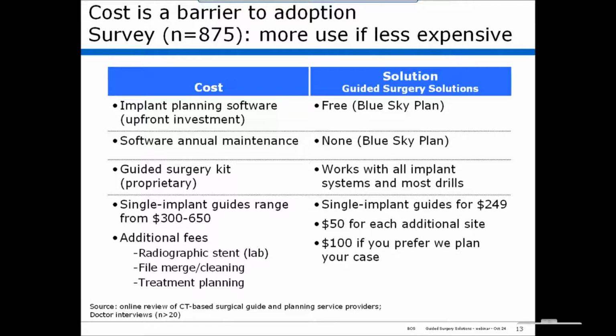What we suggest you do, and we have an illustration, I think, on our website to do this, is place 7 fiducial markers on the back of a disposable impression tray. Then you take an alginate impression of the patient's arch, and while the tray is still in their mouth, you put them in your scanner and scan them with the alginate tray in their mouth. You then take them out of the scanner, remove the impression, and pour the model.